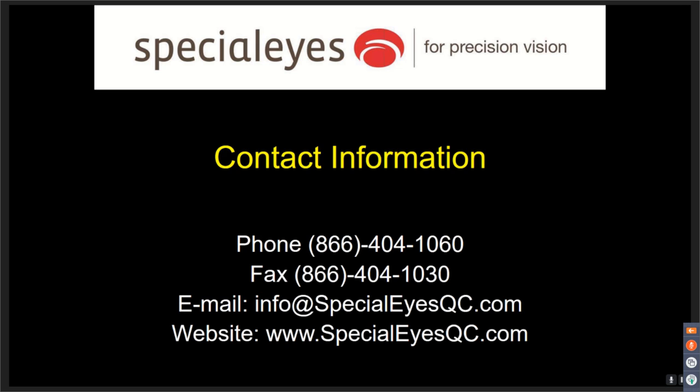Let me add something to that too. I think the original question was chair time, and what most optometrists are thinking about with chair time is the initial time that you're spending with the patient on that first day. This lens is incredibly quick because I never see the lens on the eye that first day. We're going to design a lens that we think is the absolute perfect trial lens and order it, and it'll be here in 3 to 4 days.